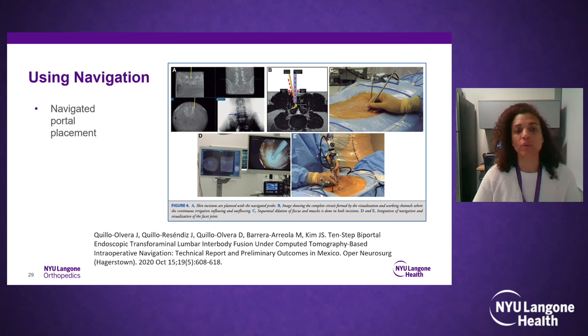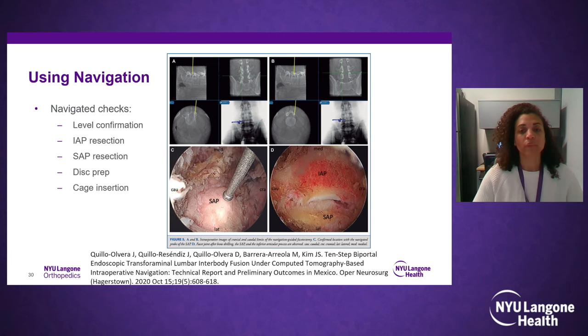Just a few notes about using navigation. This is a nice article going through step-by-step using navigation to help in endoscopic fusion cases for both portal placement and then checking where you're burring and all the different steps in your case, like checking your IAP resection. I think navigation is great when you're first starting out and doing your first few cases. Because I'm putting my screws in under robotic assistance, I have navigation right there.